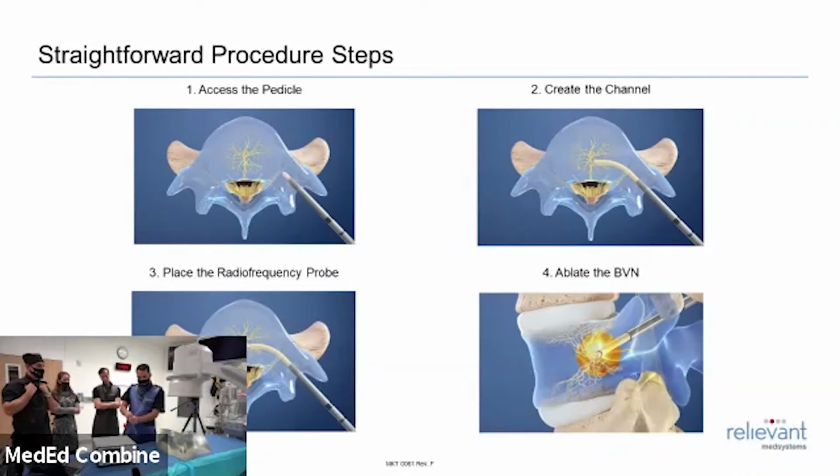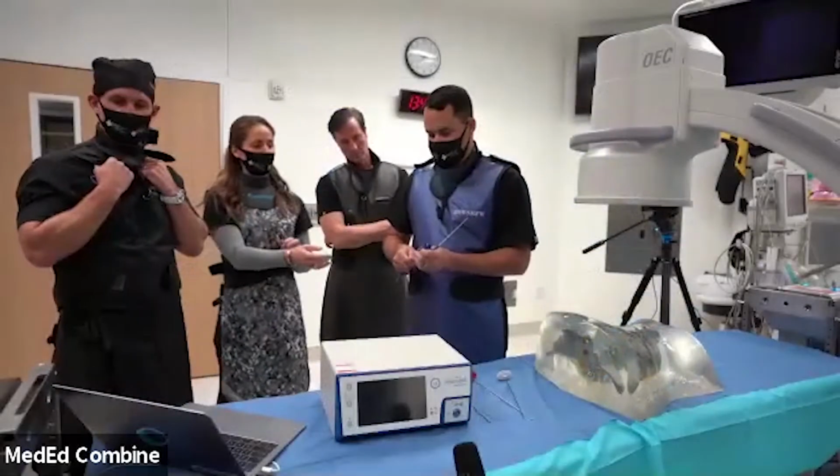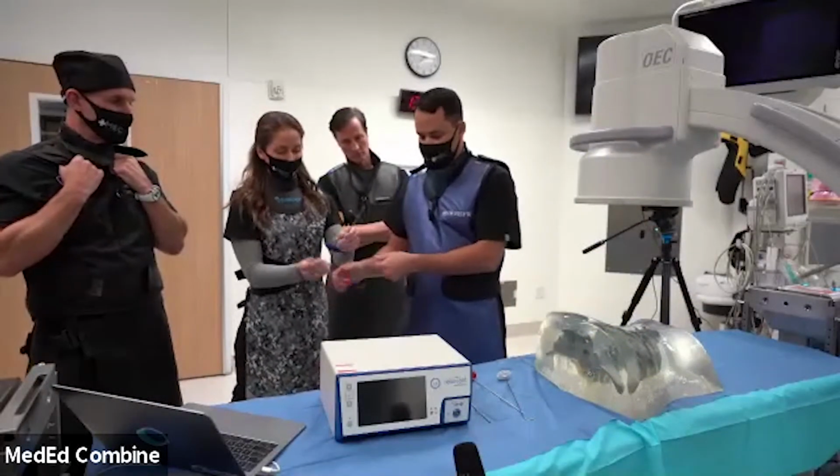Let's take this off and do it the other way. So there's a new trick where you can put the straight stylet into the curved in order to get it through a little easier. I always say the guys that were trained before that are hardened. Do you have any saline? It's not very wet. Yeah, we can just put some saline through it.